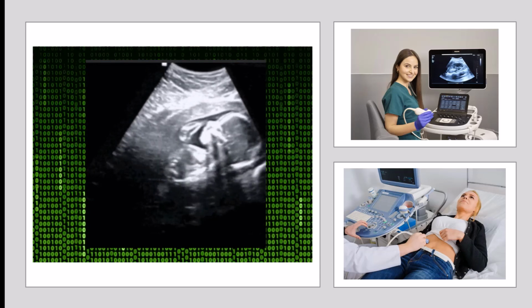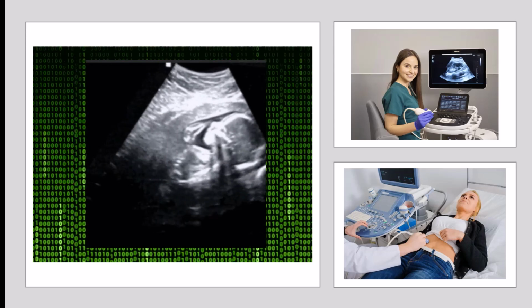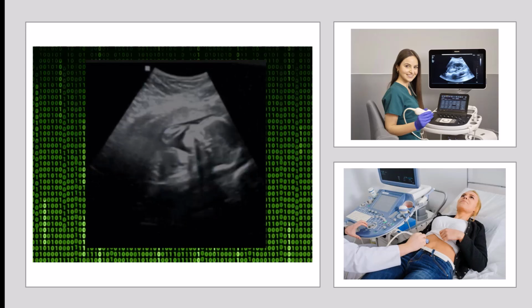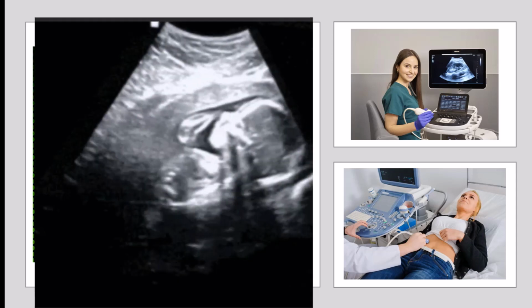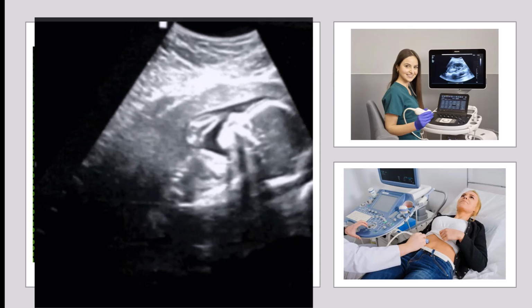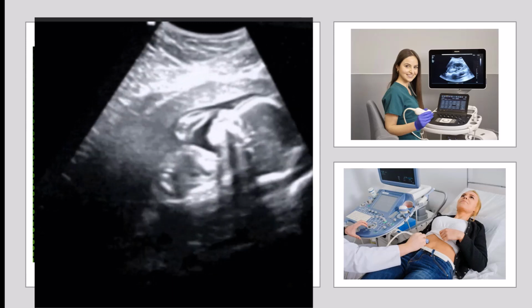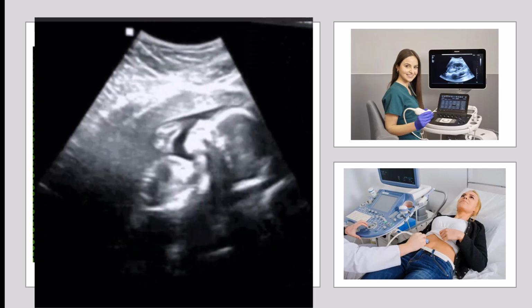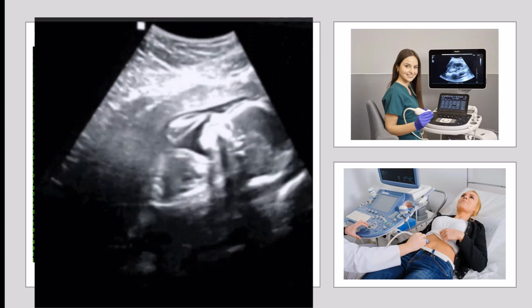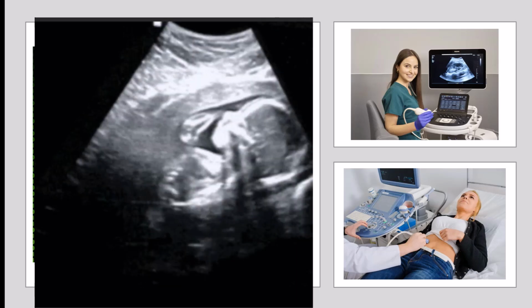So we previously changed analog to digital, or continuous to data. And now to be able to visualize this with our eyes, we're going to have to change it back to analog. So we take the numbers and reverse the process and demonstrate the shades of gray instead of numbers on the screen of our monitor.